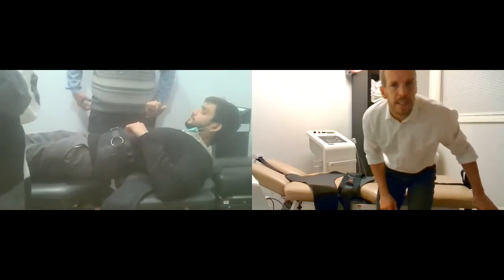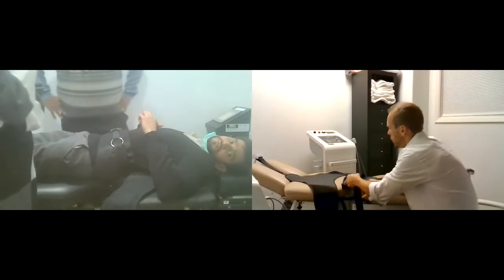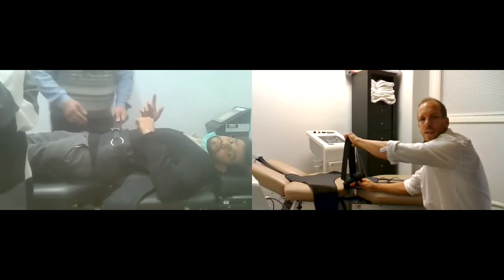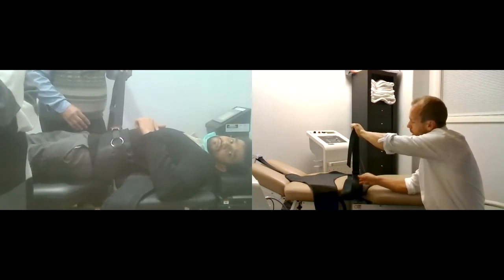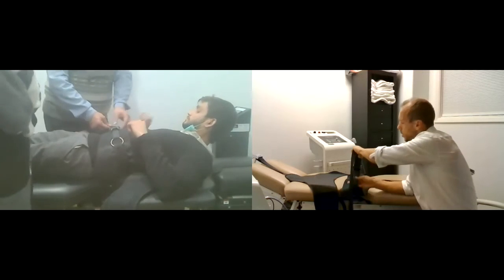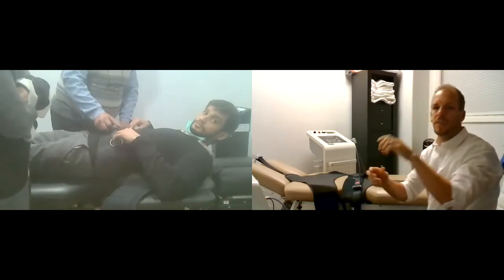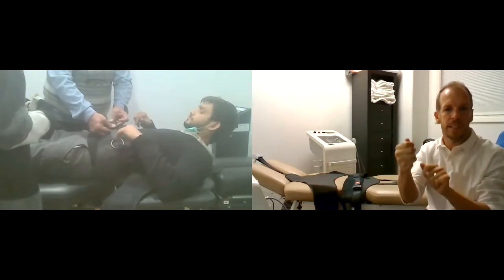Now, the easiest way to get that tight is to, with your left hand, grab the extra fabric. With your right hand, grab the fabric before it goes in through this buckle, okay? So you're gonna feed it with your right as you pull with your left.